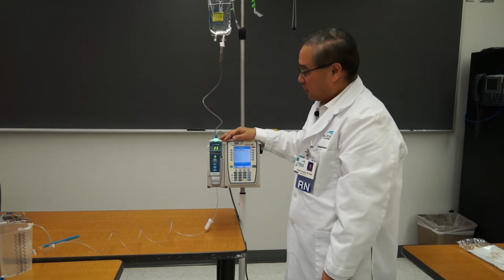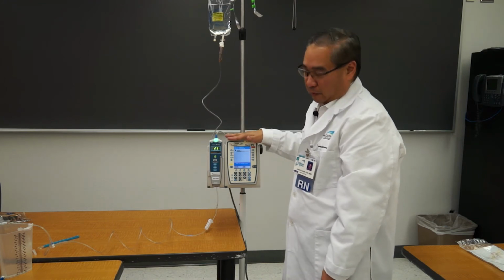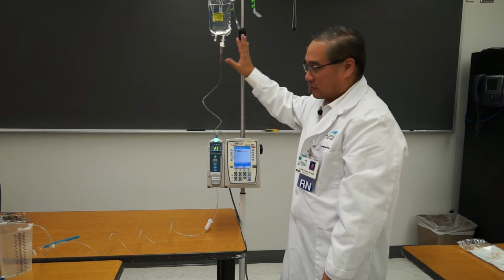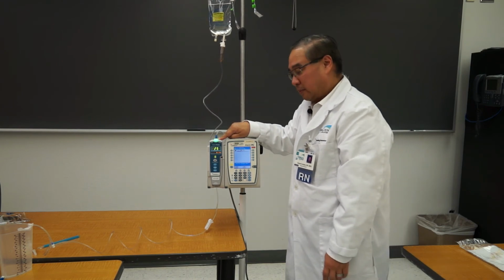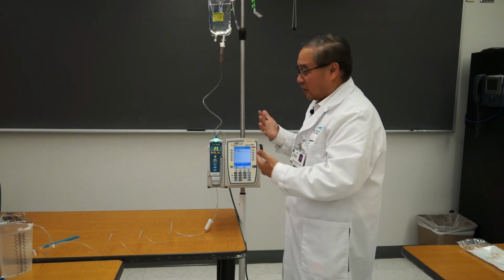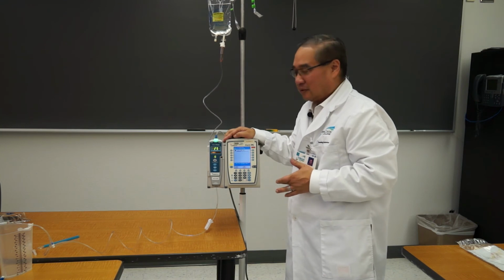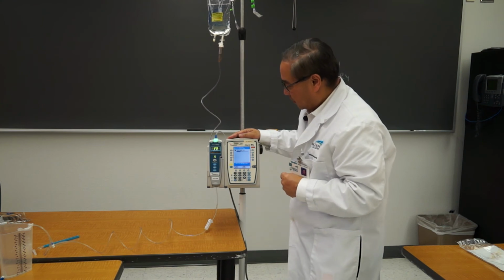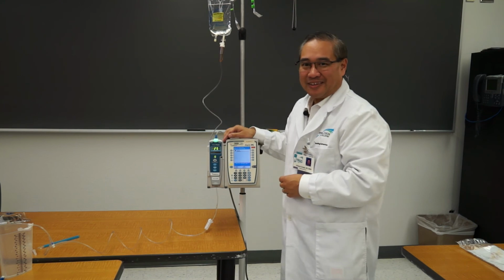Now, if it's a basic infusion, you don't need a label on here. Then basically you would input the rate and volume to be infused. It would still run, but it would not have a scrolling name of what's actually hanging. Okay, so that's it. It stays green. You want to wait about a minute or so. Maybe you're doing your hand hygiene, maybe you're talking to the patient. It's kind of one of those things that if you walk away from it, it might start beeping. So ensure that the pump is running. There's no yellow or no red, there's no bumps, there's no kinks on the way to the patient. And then you can go ahead and chart on your intake that you started the new bag. All right? Thank you very much.